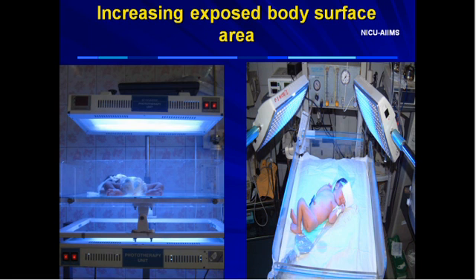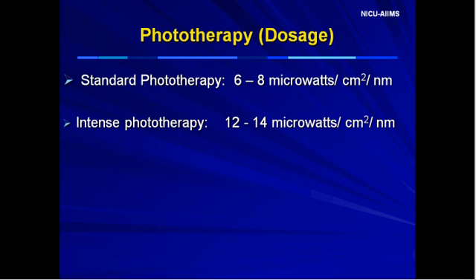Effective phototherapy is very much dependent on the exposed body surface area. The greater the area exposed, the greater the fall of total bilirubin. With the present overhead and underneath devices used singly, only up to 30% of the body surface area is exposed to light. In term newborns with significant hyperbilirubinemia, studies suggested that double phototherapy provided rapid and more effective bilirubin reduction than conventional phototherapy alone due to higher spectral irradiance and greater body surface area exposed.